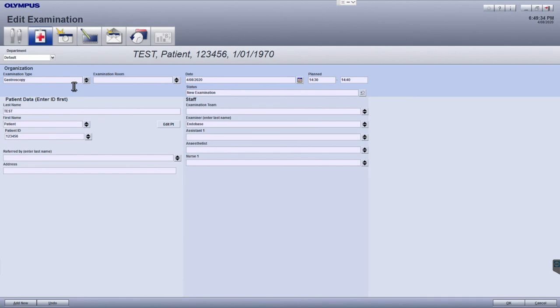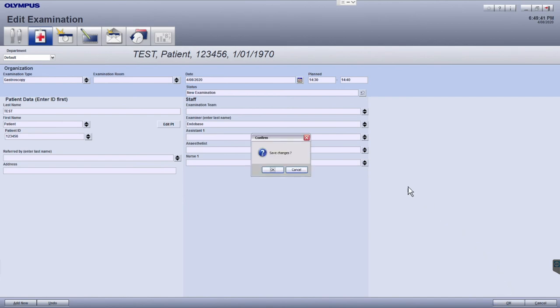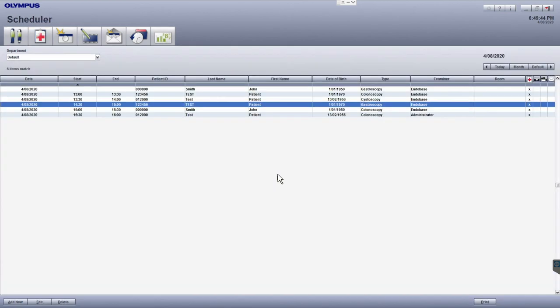Once you've updated the necessary fields, click OK in the bottom right. Then click yes to confirm the changes and return to the scheduler home screen.